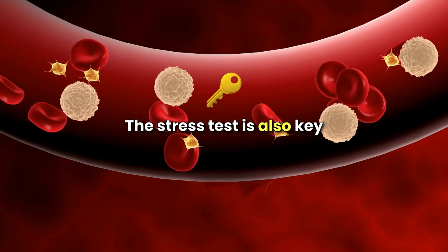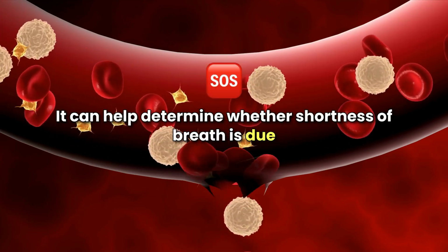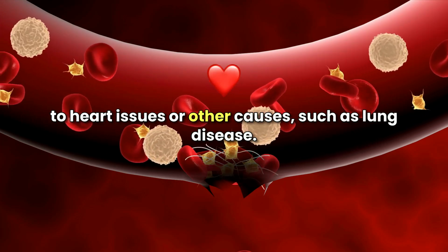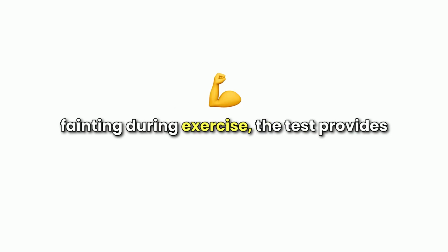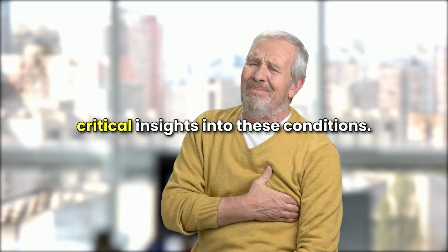The stress test is also key in evaluating exercise-induced symptoms. It can help determine whether shortness of breath is due to heart issues or other causes, such as lung disease. For those experiencing irregular heartbeats or fainting during exercise, the test provides critical insights into these conditions.